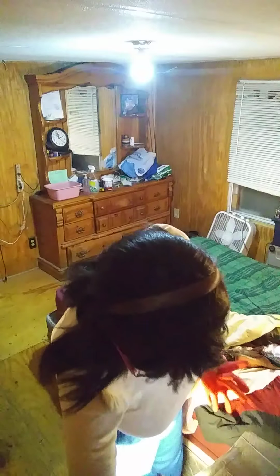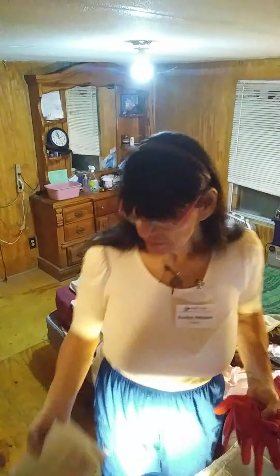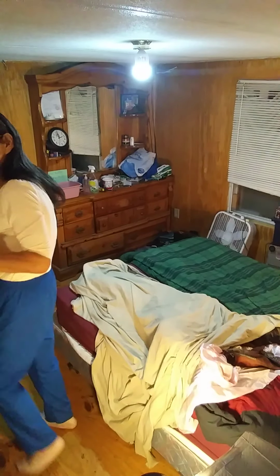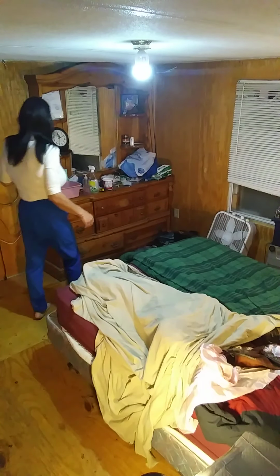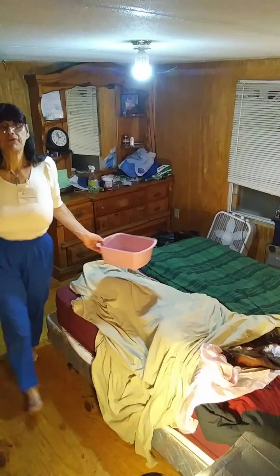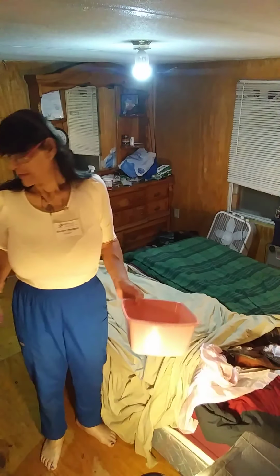And I'm going to get one pair of gloves and 3 washcloths. And we're going to get our basin and some soap. We have our basin and some soap.